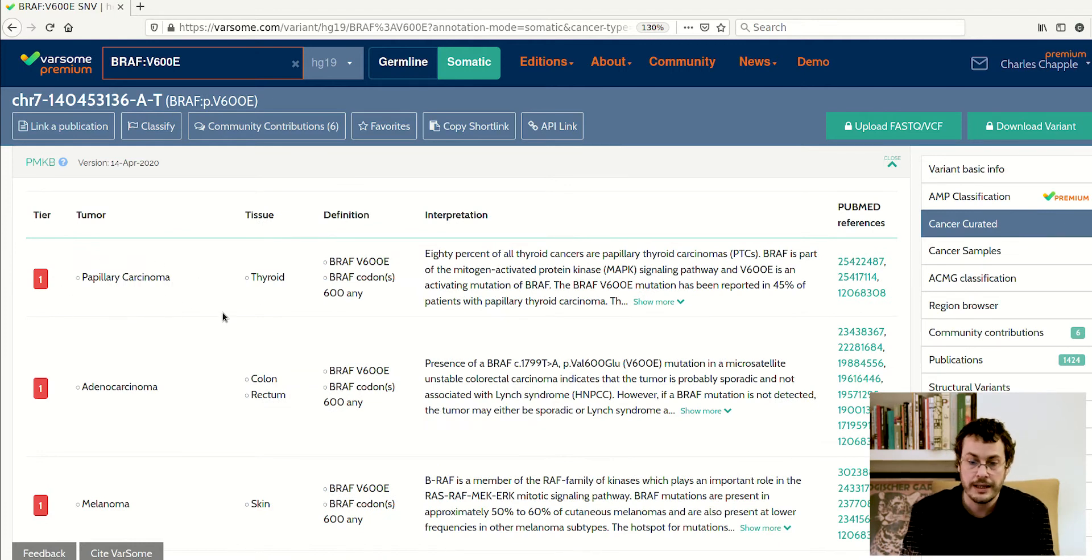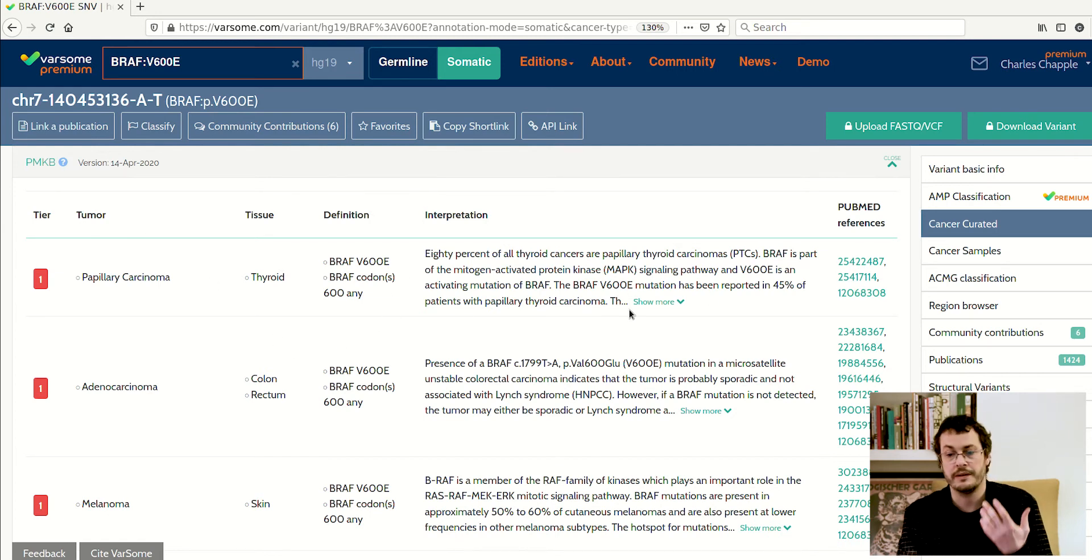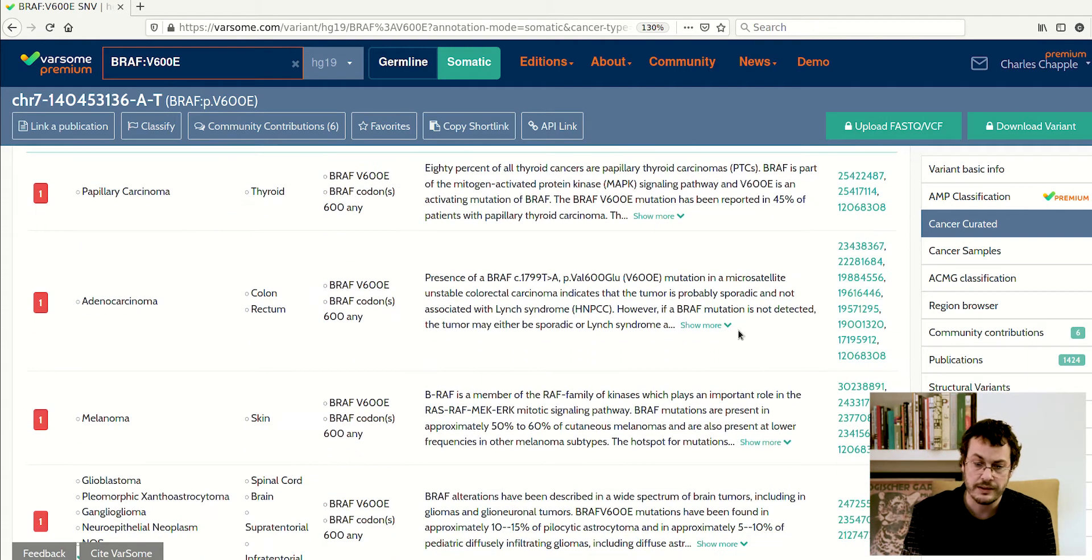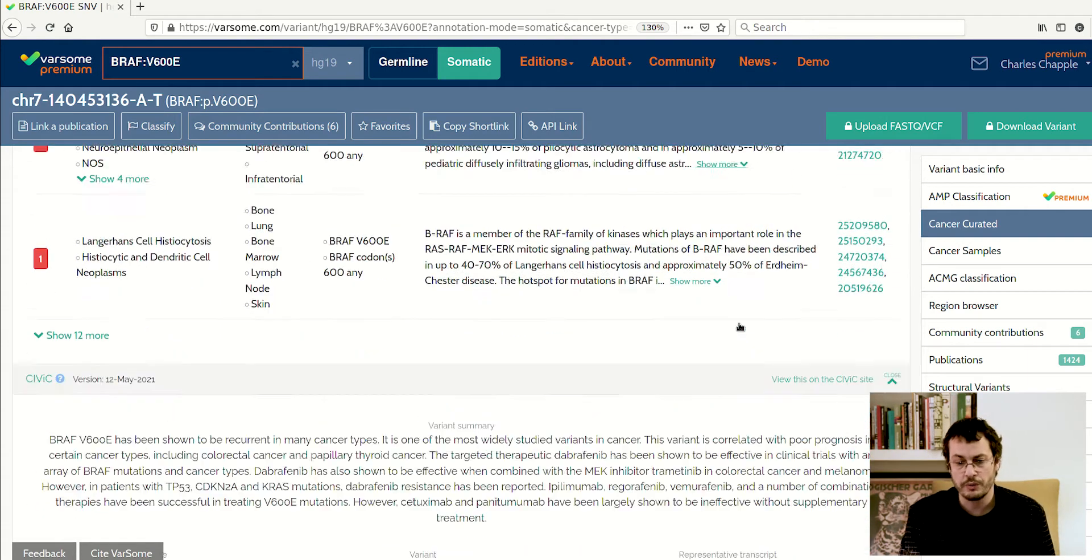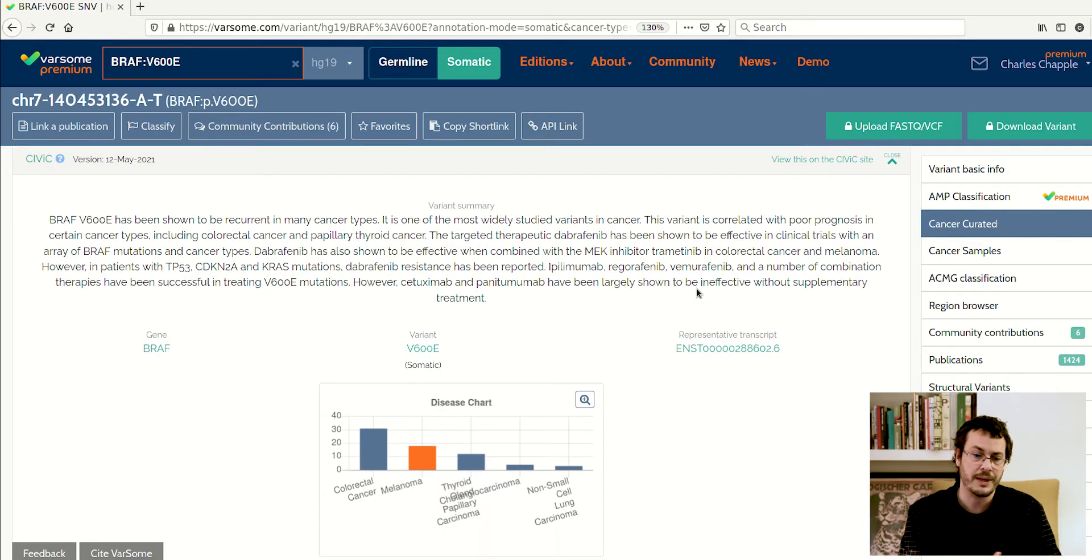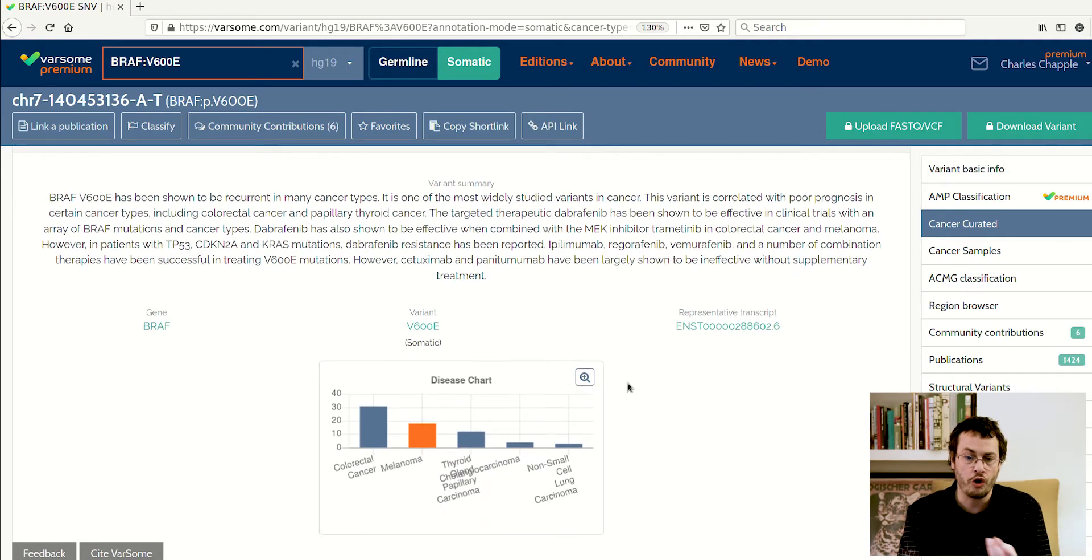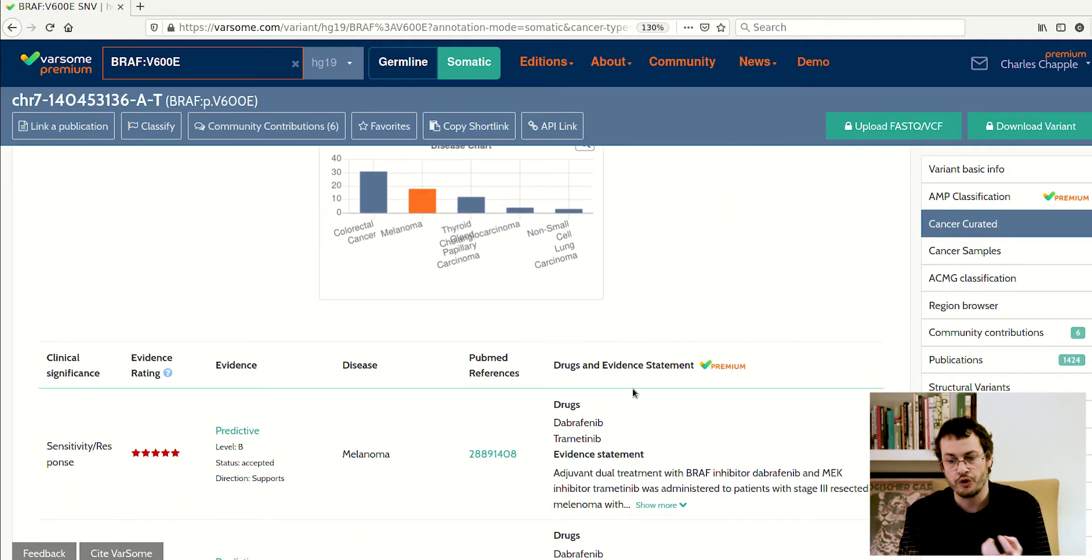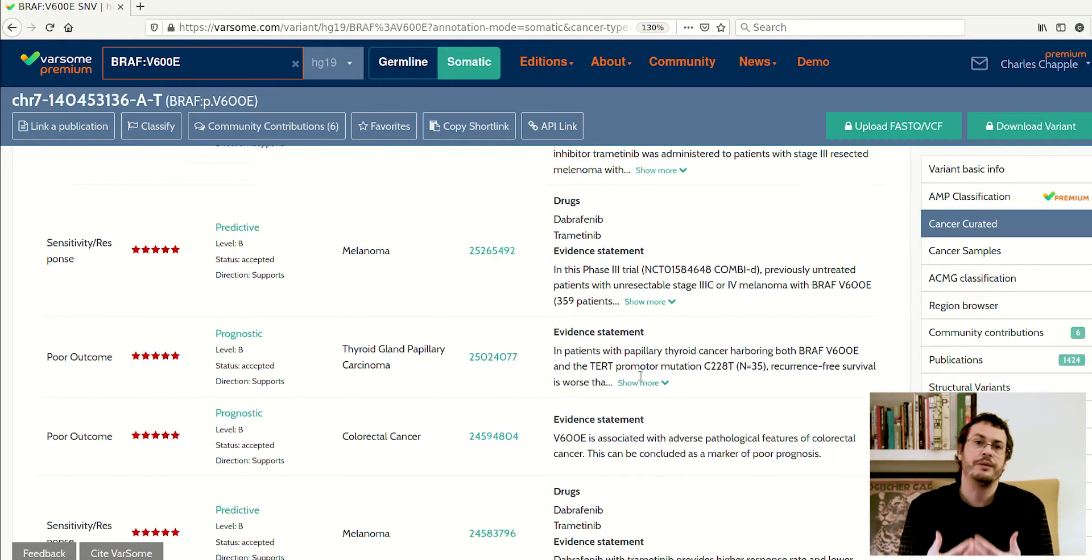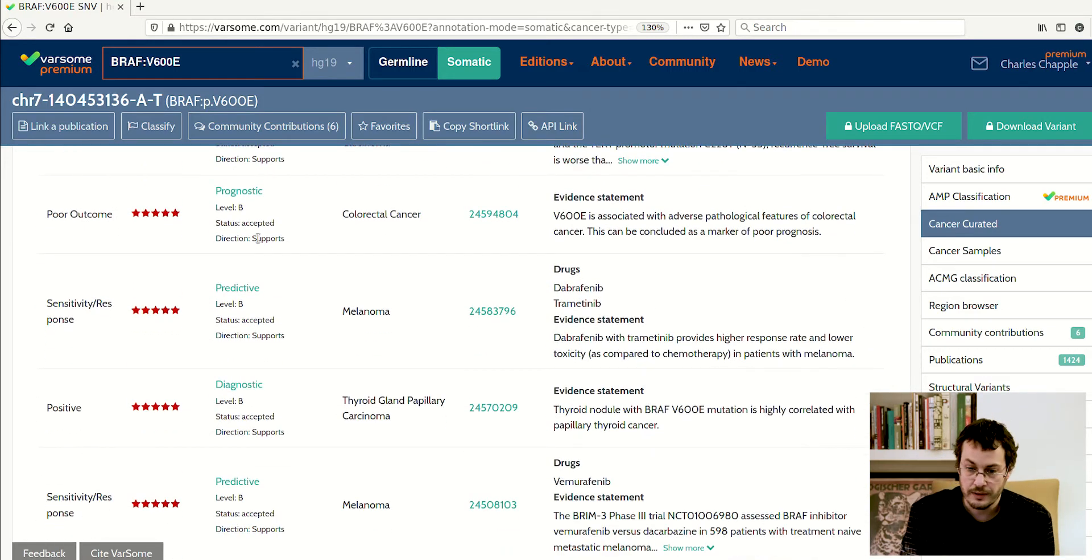So here we're looking at PMKB, and here we can give you the tier it was placed in for this particular cancer in this particular tissue, the interpretation given, and the PubMed references, the published papers supporting these findings. As you scroll down, you'll see more databases, and each of them has a different type of information about the variant and its position in different cancer types.